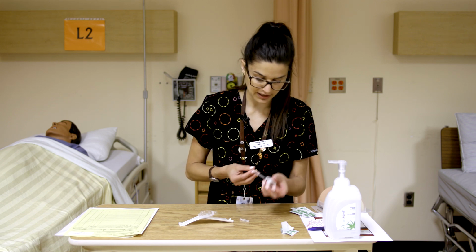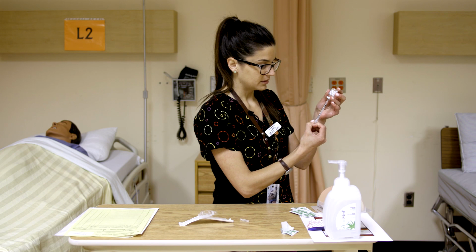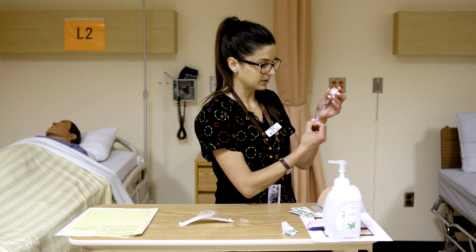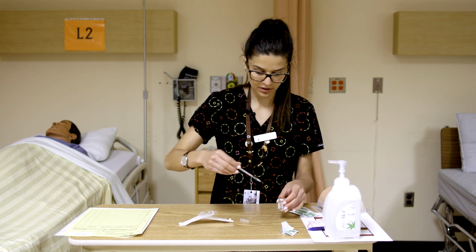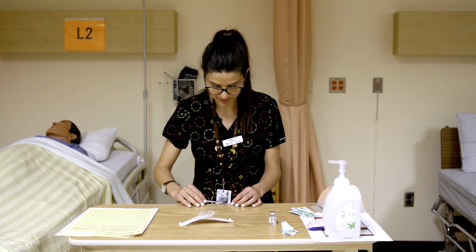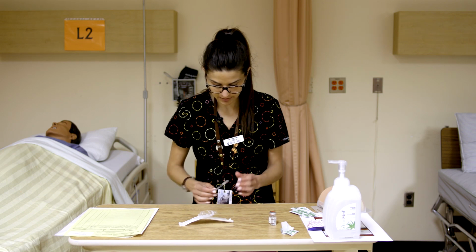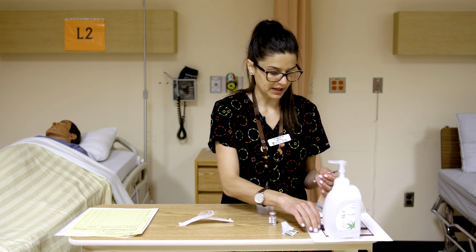So we're going to inject that air, and now we're going to pull back on our plunger. And we're going to try to get out a little bit of excess because I do see a bubble down there. So we're going to pull out. We're going to recap using our scoop method and push. So I like to use a pen.